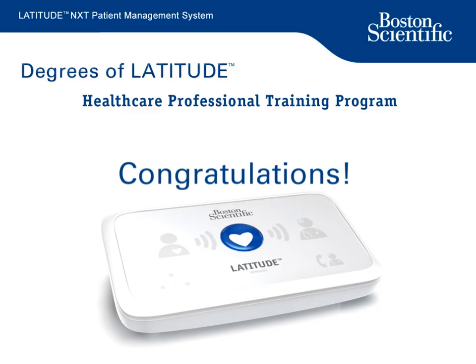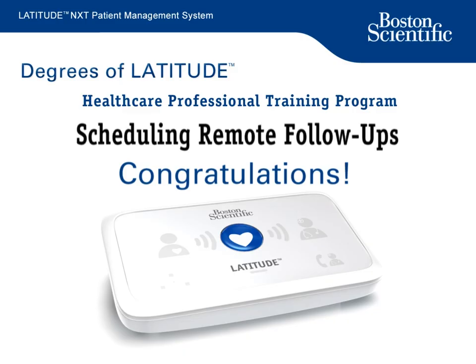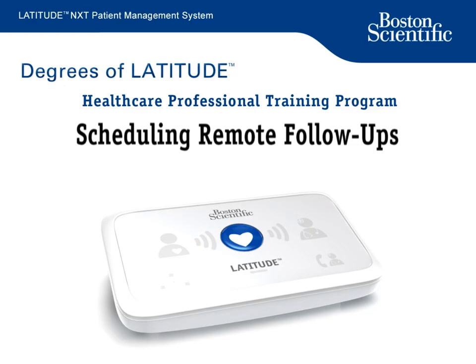Congratulations! You successfully completed the Degrees of Latitude module on scheduling in Latitude NXT.